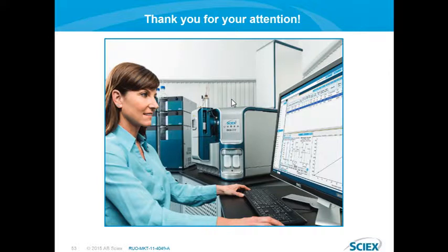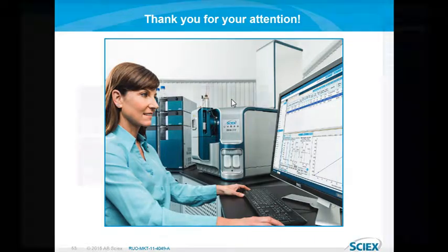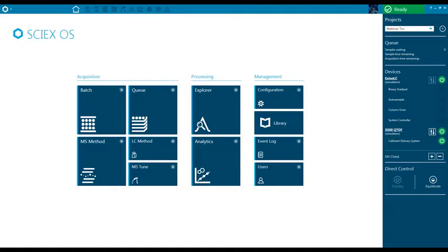And now, to finish this presentation, I will show you some details and key elements of the SCIEX OS software live directly in the software interface. Here is the interface of the software SCIEX OS. You can see that at the left you have the acquisition module with the LC method and MS method menus to create and to modify the methods.